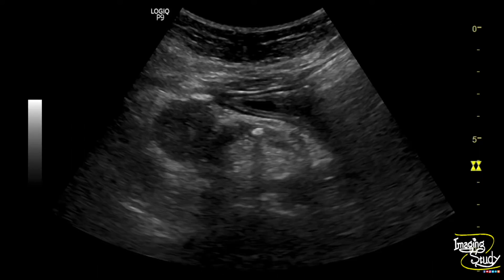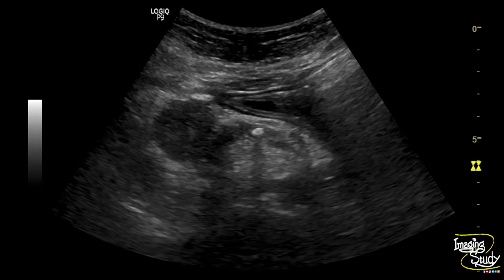This is the mass at the head of the pancreas. This is the hyperechogenic stone within the main pancreatic duct casting posterior acoustic shadow. And here you can see another heterogeneous hypoechoic area posterolateral to the pancreatic head mass — this is the collection we saw on the video. Overall, the pancreatic parenchyma is thin and echogenic, indicating the features of chronic pancreatitis.